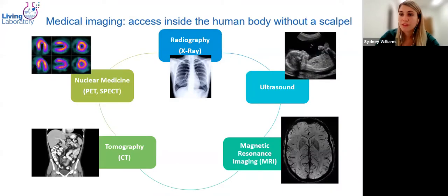But before we begin with MRI in general, I want to talk to you about the bigger concept of medical imaging. Medical imaging is a really powerful diagnostic tool because it allows us to see inside the human body without cutting us open. You don't need a scalpel. On this screen, you can see some of the most common categories of medical imaging modalities. Front and center, we see an X-ray or radiography, which I think everyone is mostly familiar with. A common use for it is a chest X-ray.